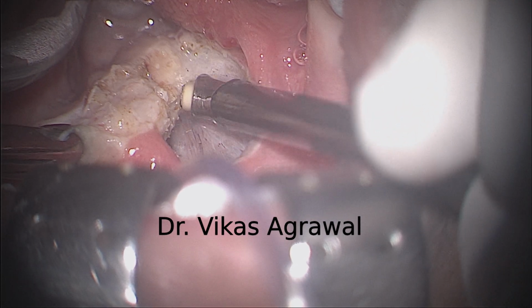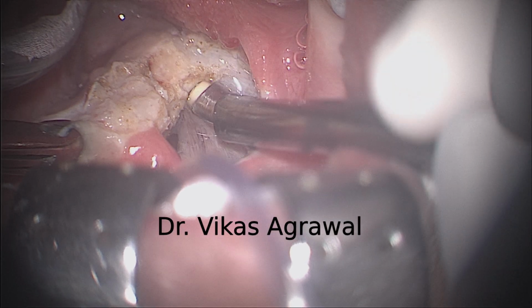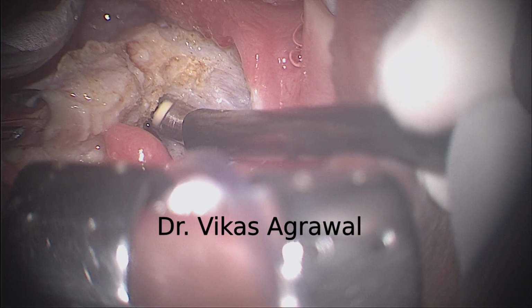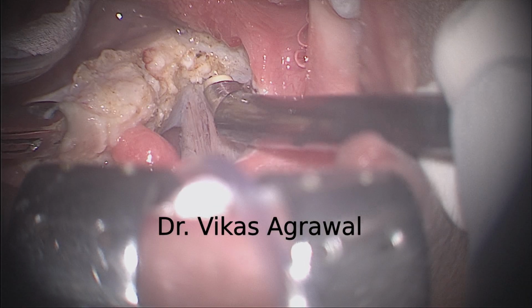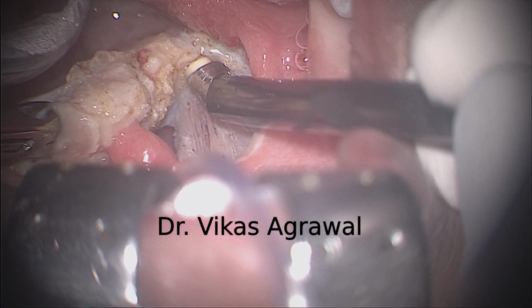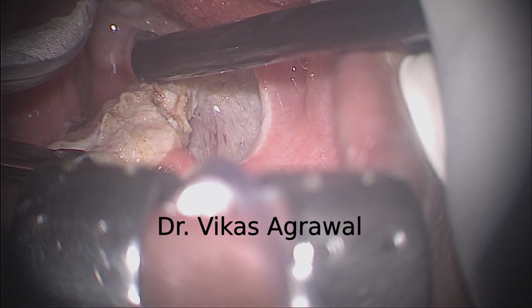And then dissect along the medial aspect. And you see there is hardly half a millimeter of tissue which again I am coagulating. So there is practically nothing left, but the chances of bleeding are minimized because you are not directly dividing the tonsillar artery. So severe bleeding by the tonsillar artery becomes very, very unlikely. Now you see this is the end of the tonsil.